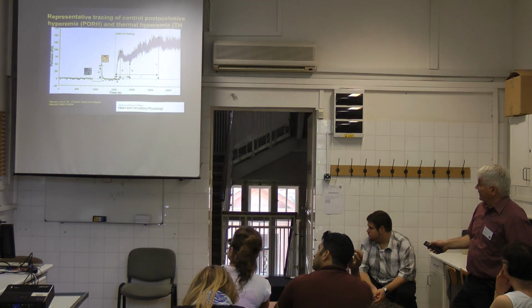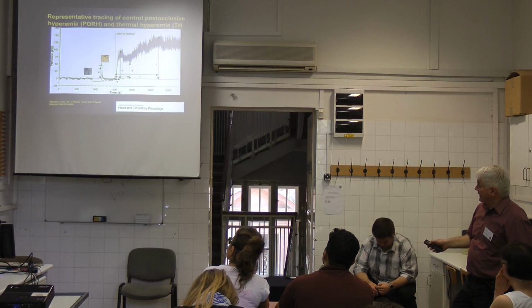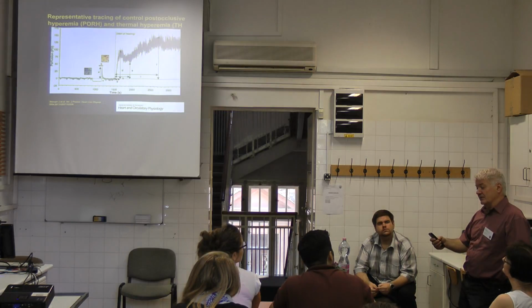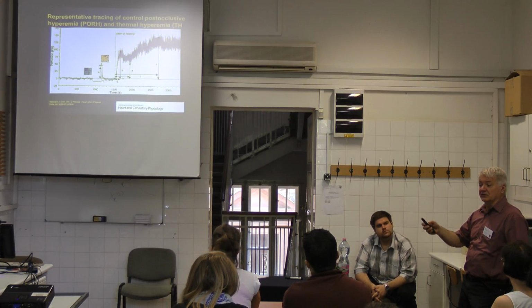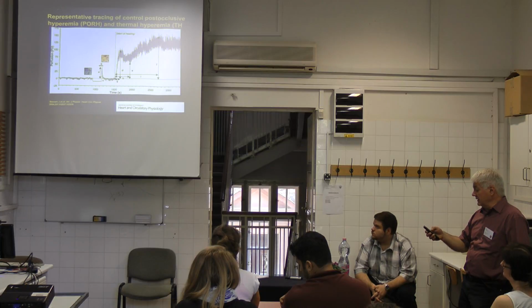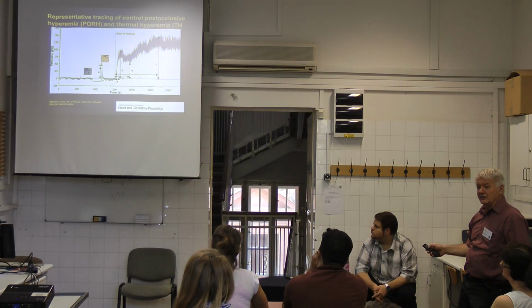And this of course is the reactive hyperemia. Again, it was closed here, occluded, released back to normal, and then heating started. As I mentioned, heating is also a stimulus, and normally in the skin microcirculation, heating goes from 32 degrees centigrade to 42, because above 42 or 44 it is painful. And you see here the dynamics toward a new equilibrium. But what can you also see in this picture?